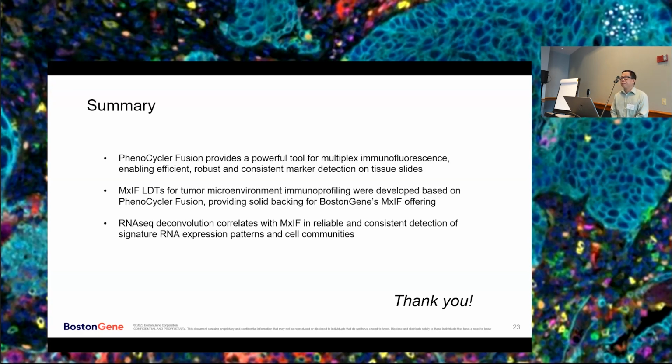Awesome, thank you. I have a couple more questions. Yue, who is actually from Akoya, asks, if CD11C has non-specific binding with SMA, what other marker will you use for dendritic cell detection? Currently, we still rely on CD11C, but for different cell types, we essentially phenotype each cell based on not just a single marker, but a combination of multiple markers. Awesome, that's great.